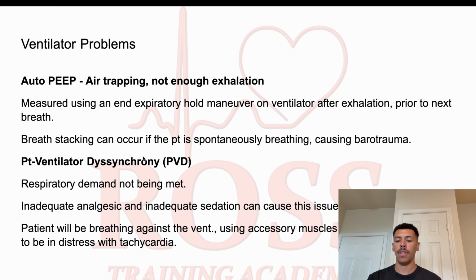And then we have PVD, patient ventilatory dysynchrony, and this is just going to be the patient's respiratory demand is not being met, and so there's either a problem with the ventilator settings, or the patient is not properly sedated, or their pain's not being managed properly. And so now you're going to start seeing kind of those anxiety-like symptoms. And this can even happen if you have the patient paralyzed but not properly sedated.